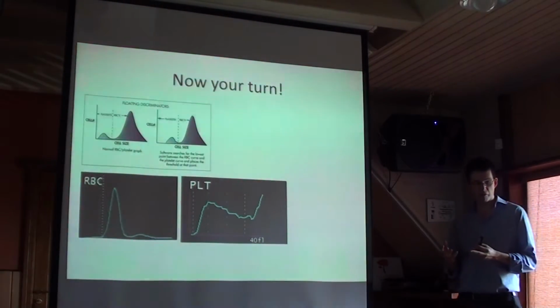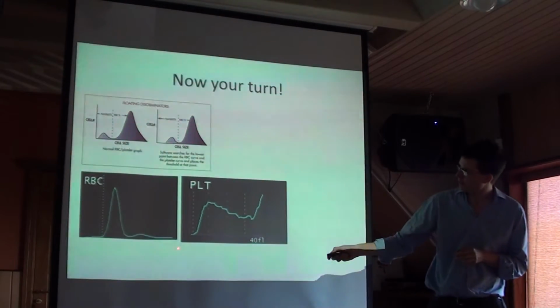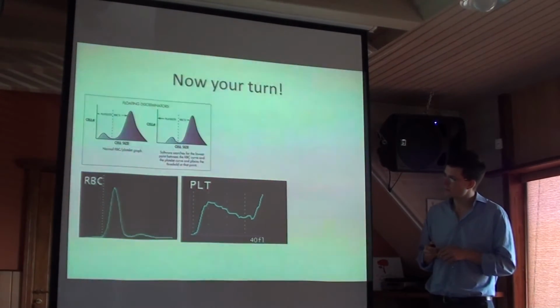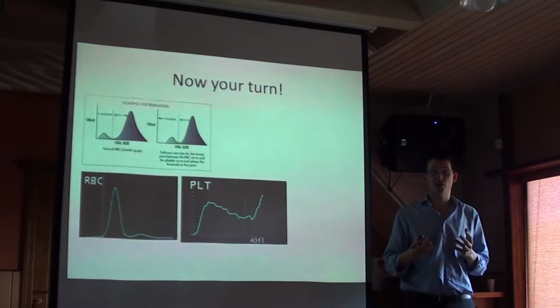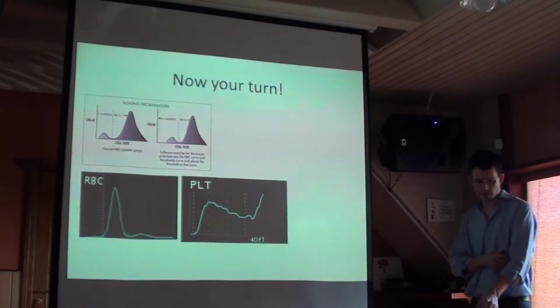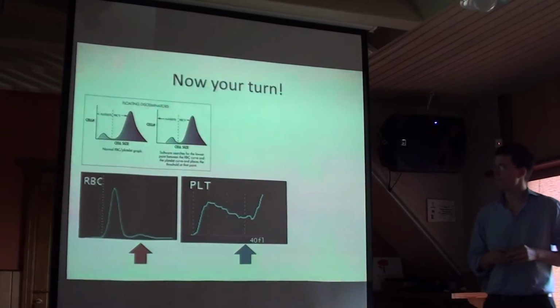We have an example from a different analyzer. Siin on nüüd näide ühest teisest masinast. Again, we have magnification of this area to show us the platelets here. Samuti verelistakute ala välja suurendatud. And again, you can see platelet aggregation. Samuti jälle verelistakute agregeerumine. It's harder to guess what's wrong in terms of the reported concentration, but I would not trust the platelet concentration from this analyzer. Ka jälle raske otsustada, mis on mõõtmisel valesti, aga selge on, et verelistakute üldarvu ei saa usaldada.